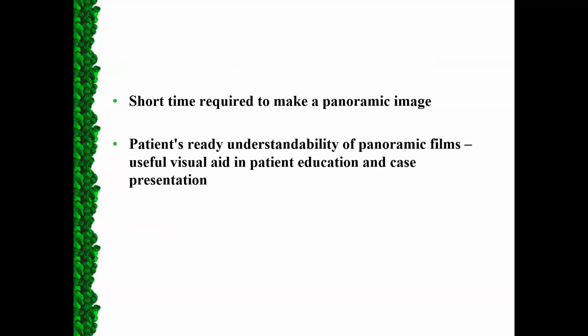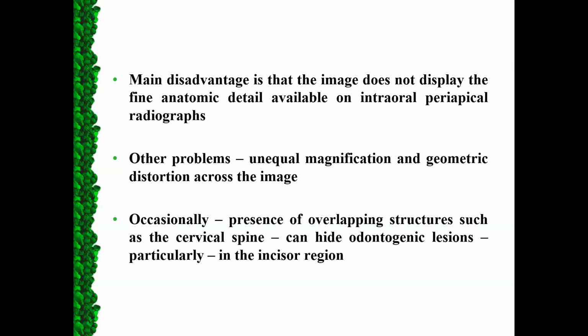Also, this imaging system requires very short time to be completed, and the image can be obtained in a very short time. The patient's ready understandability of panoramic films is a useful visual aid in patient education and case presentation.